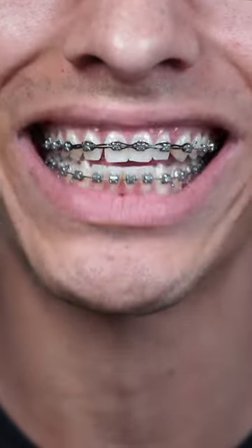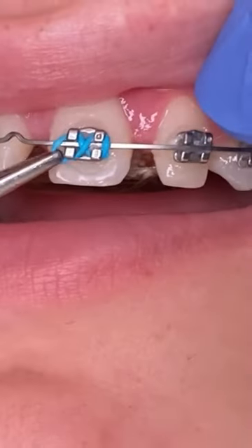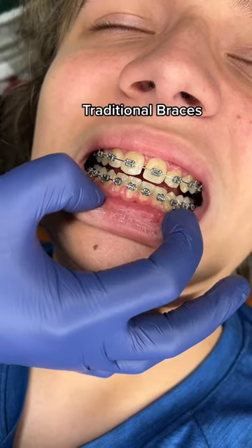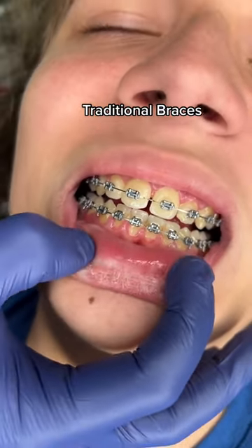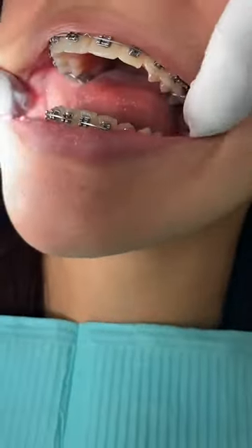Why do my braces not have colorful bands on them? That's because braces are available in various types to suit different orthodontic needs and personal preferences. Traditional metal braces consist of metal brackets bonded to the teeth and connected by arch wires, which are gradually adjusted to move the teeth into the desired positions.